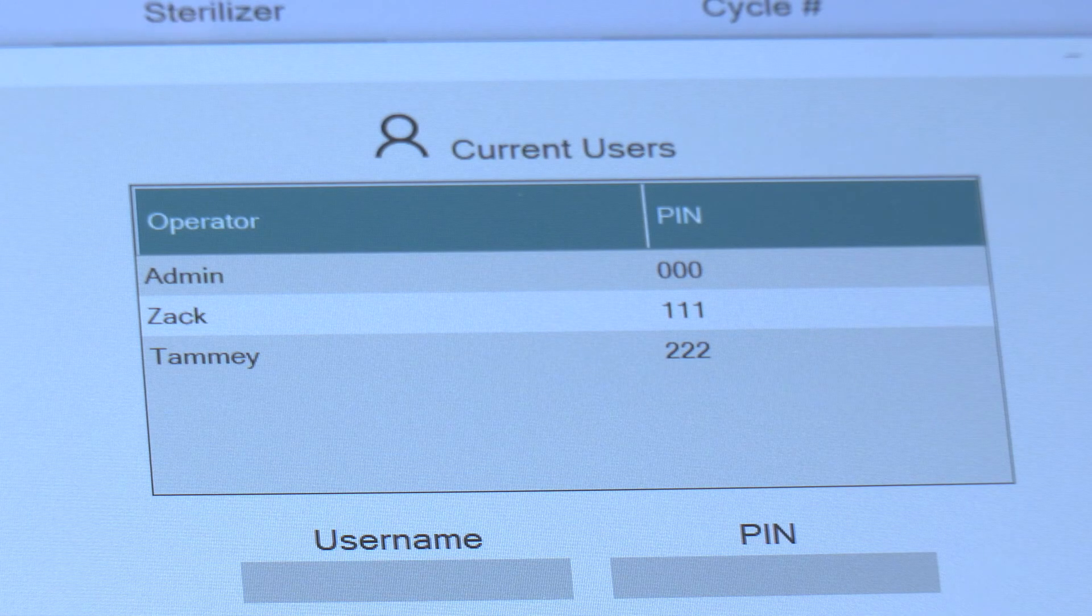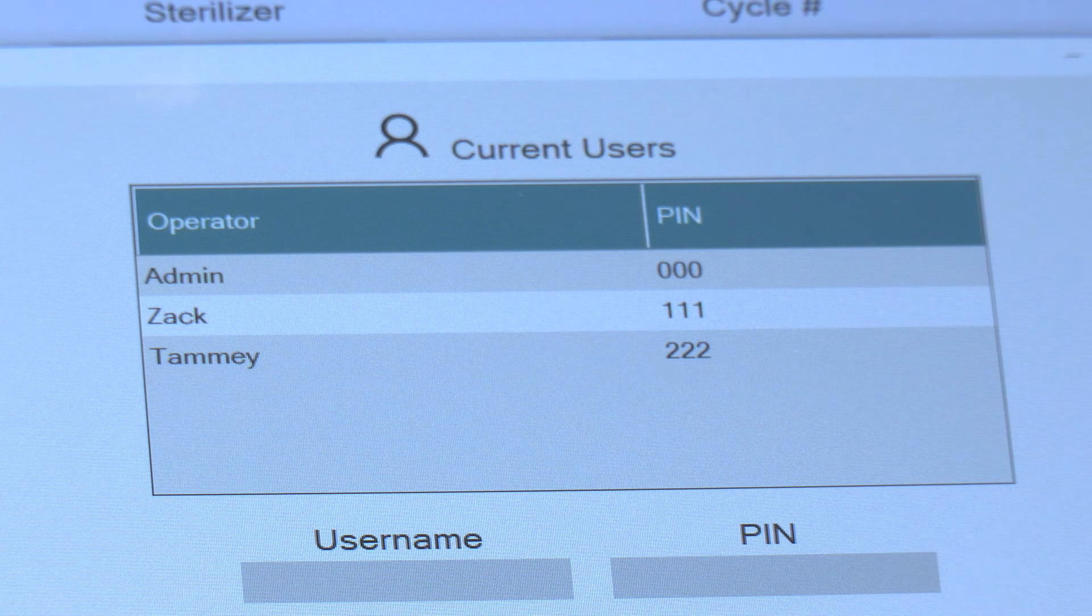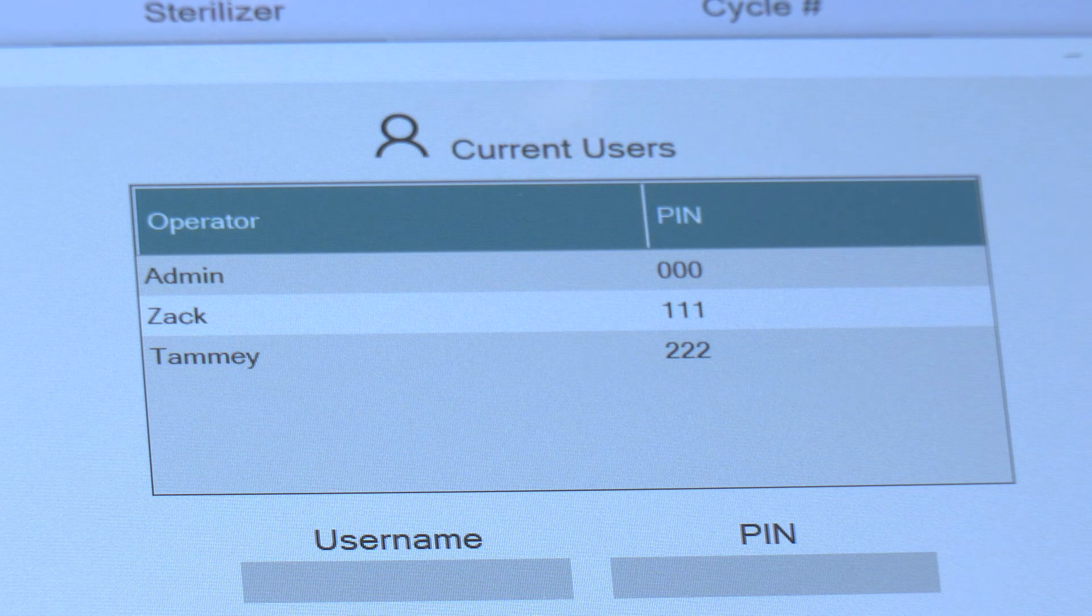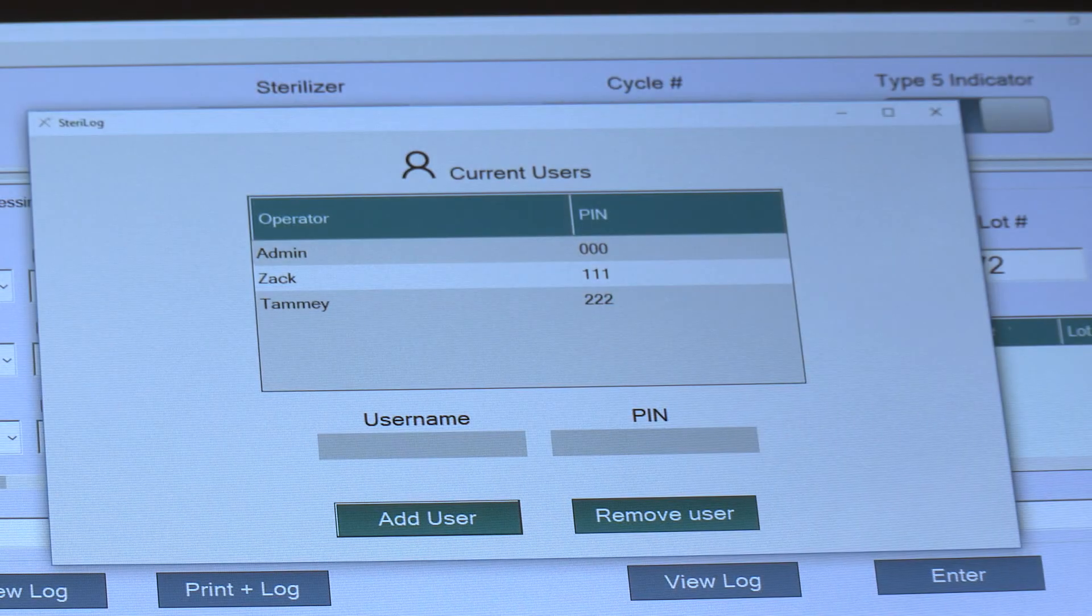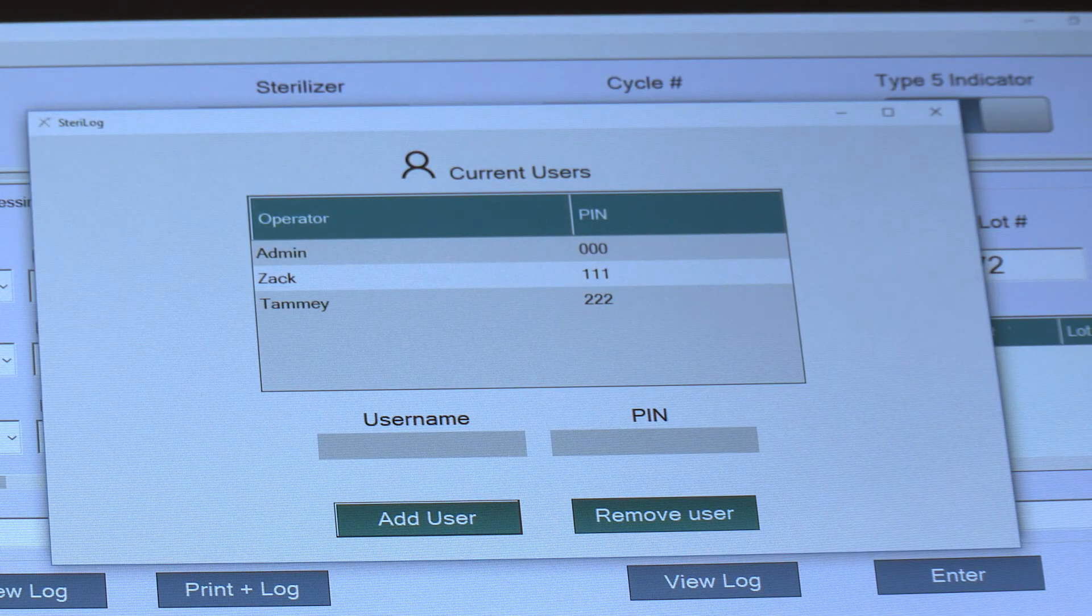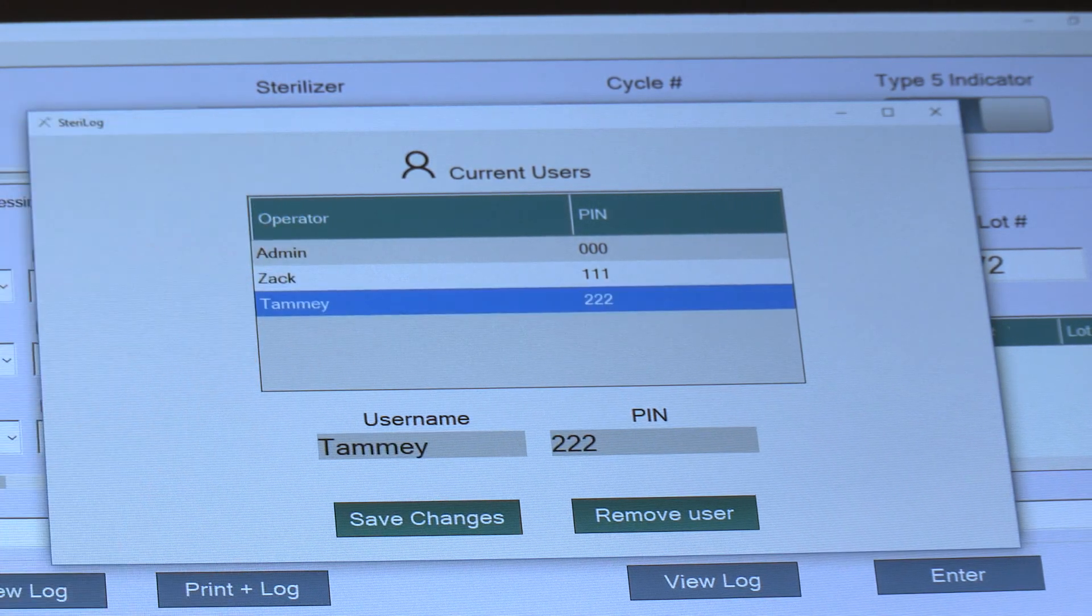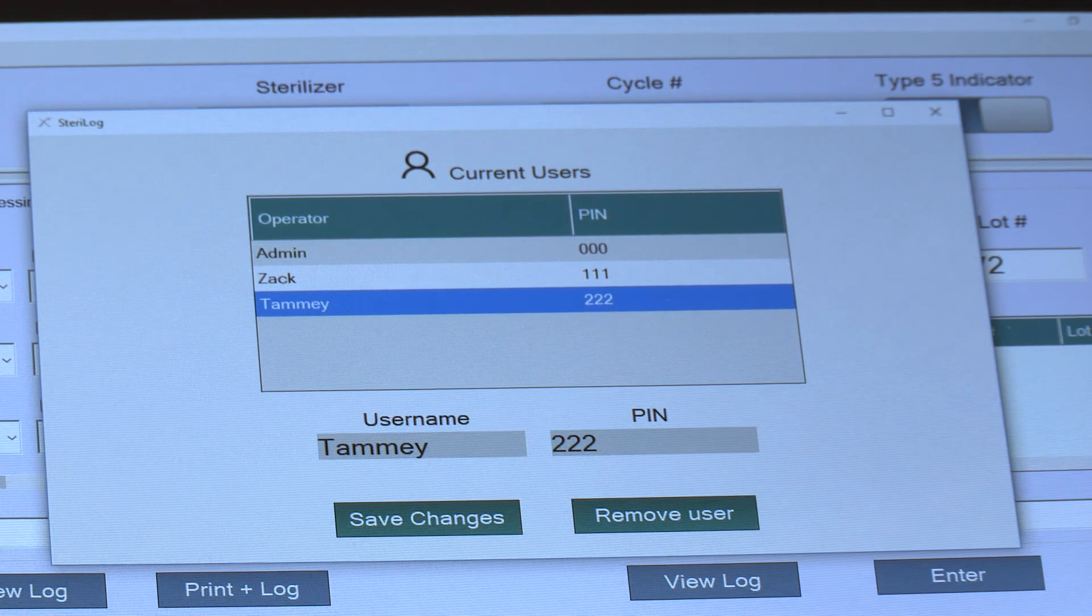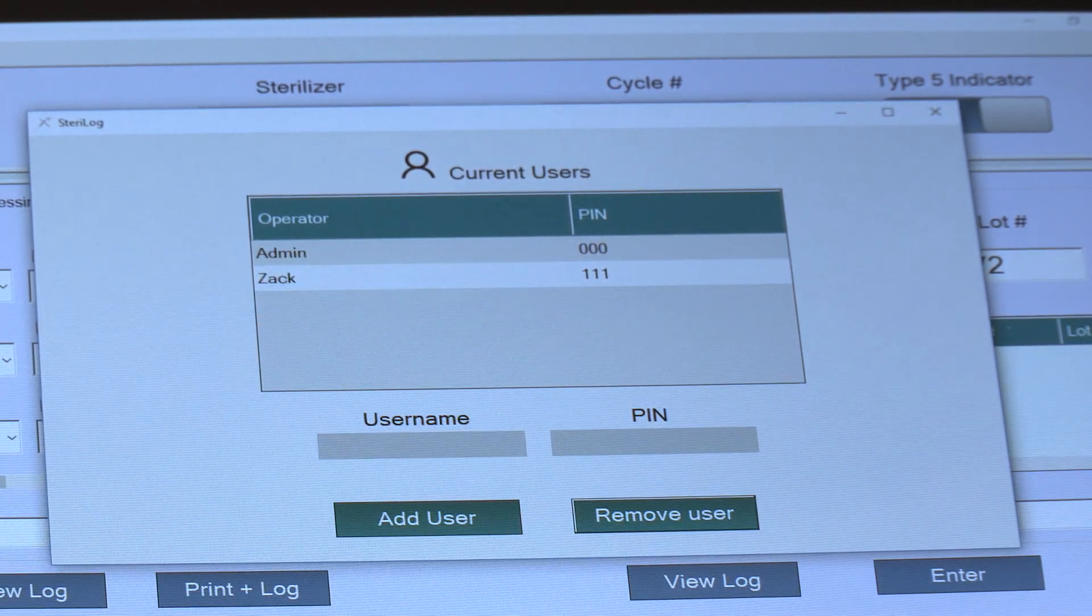And you'll notice that Tammy has been added as an operator with the associated PIN that we've assigned her. To subsequently remove a user at a later date, all you would do is highlight the particular user that you would like to remove and hit Remove User at the bottom.